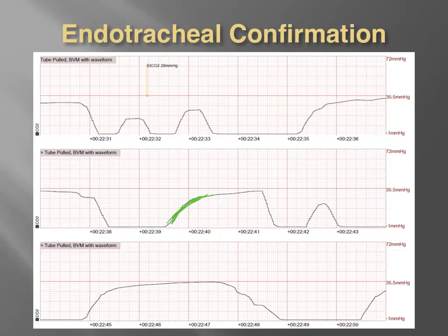But where the bag valve mask in combination with capnography is so great is that you can actually ventilate the patient before intubating and know that your ventilations are getting in place. Or in the case of a drug addict, where you just need to support ventilations for a very short amount of time, you can help identify whether or not the ventilations are getting in the right spot.